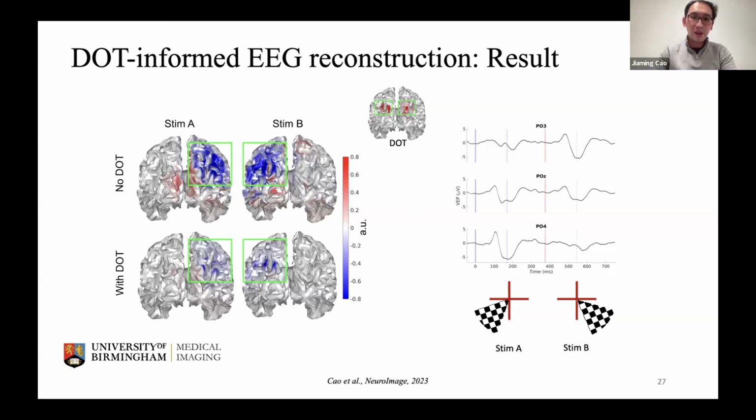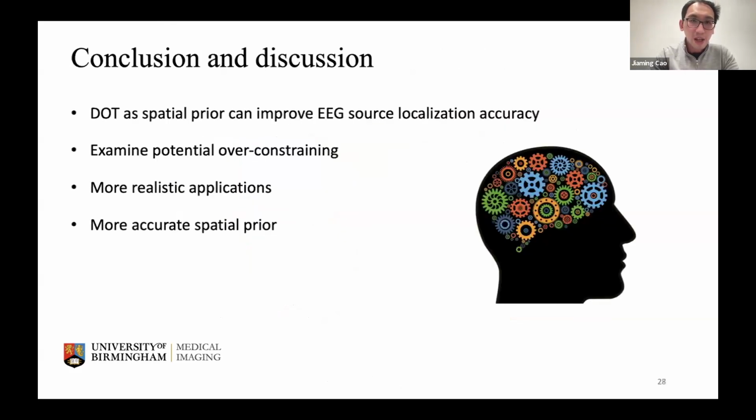So this is the theory and the results of this NeuroImage paper that we published last year. So we would like to call it success. This is really promising in the sense that if we fuse these two different modalities that are simultaneously recorded, we can theoretically do this kind of a spatial-temporal reconstruction of neuronal sources, and that is indeed validated using both simulated and human retinotopy data.